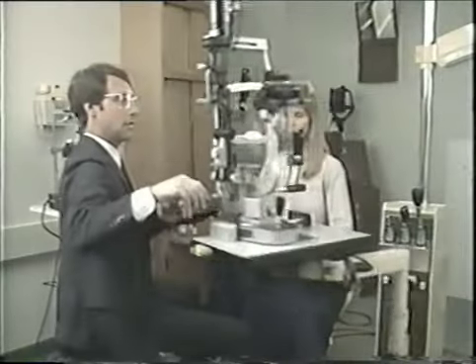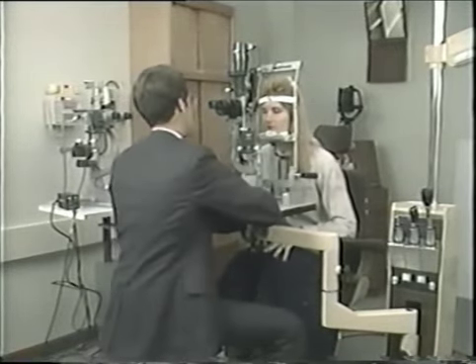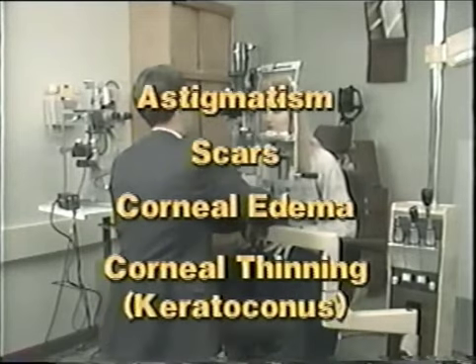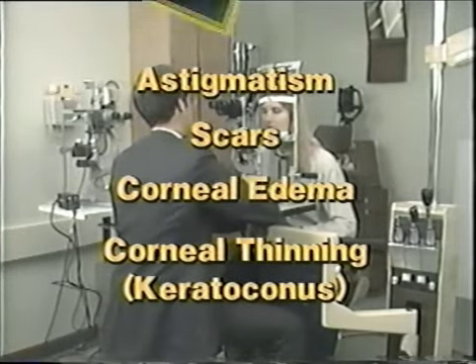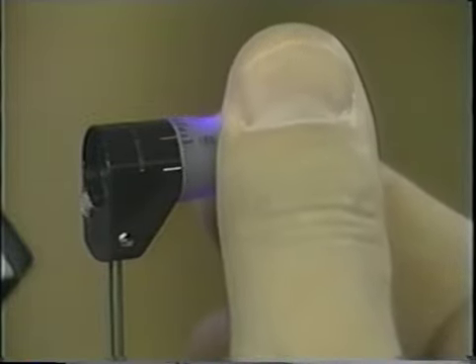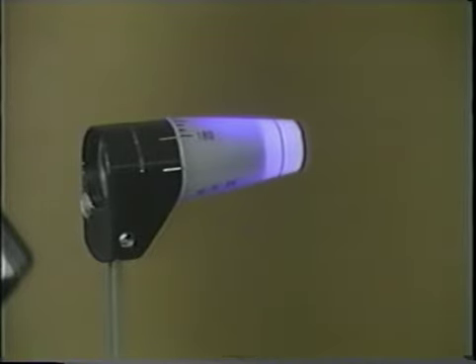Although Goldmann applanation tonometry is widely accepted and shown to be highly reliable, it is not without problems. Some of the difficulties are encountered in patients with surface changes on the cornea, including astigmatism, scars, corneal edema, and corneal thinning, or keratoconus. Astigmatism due to abnormalities in corneal curvature of greater than 3 diopters may influence the reading by producing an elliptical area of corneal contact. This can be minimized by adjusting the axis of the biprism. Convert the patient's refraction from plus to minus cylinder. Then set the red line on the prism holder to minus cylinder on the prism scale.